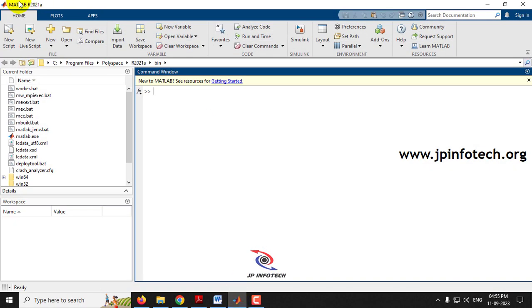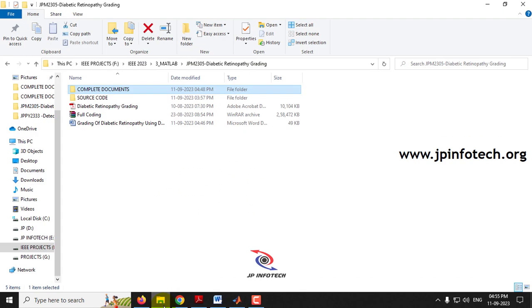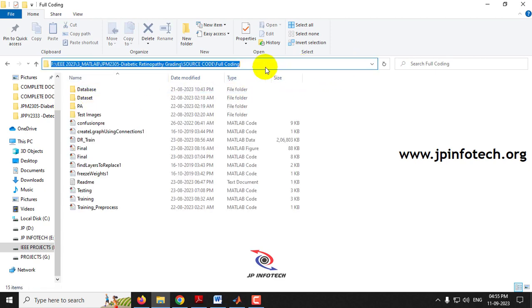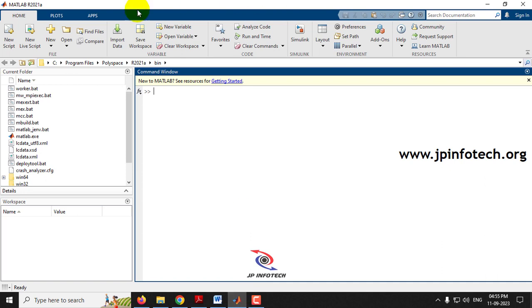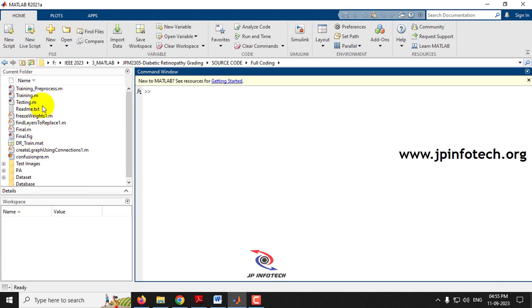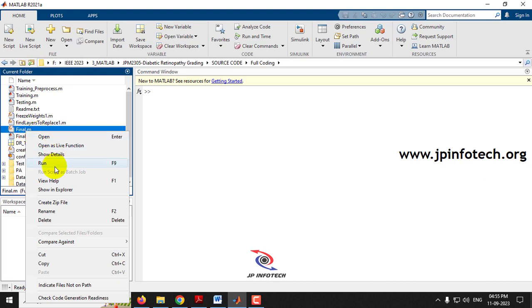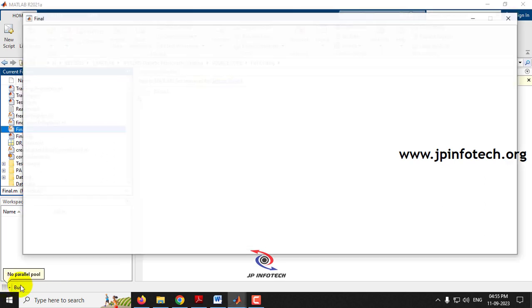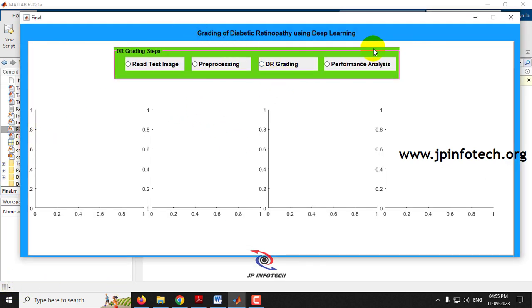Now let's execute the project. Open MATLAB 2021a, navigate to the source code location by copying the path from the address bar, and paste it into MATLAB. Select the 'final.m' file, right-click it, and select Run. The system processes and the GUI loads, showing the project title 'Grading of Diabetic Retinopathy Using Deep Learning' with steps: Read Image, Pre-processing, DR Grading, and Performance Analysis.